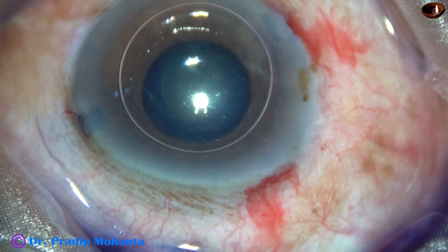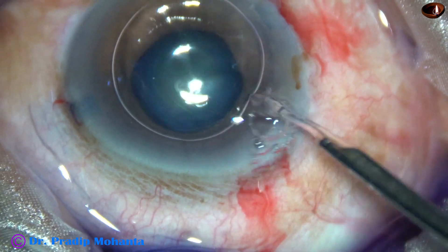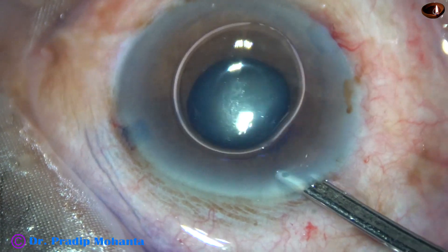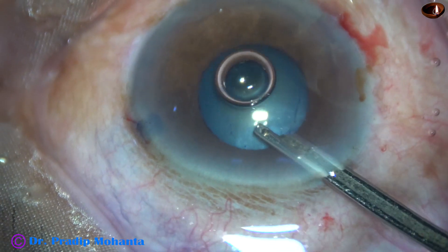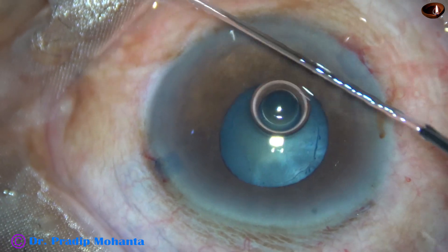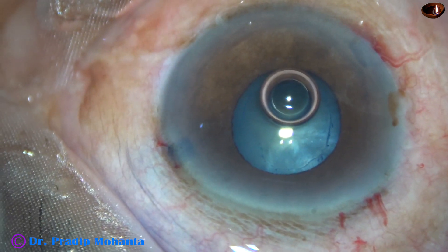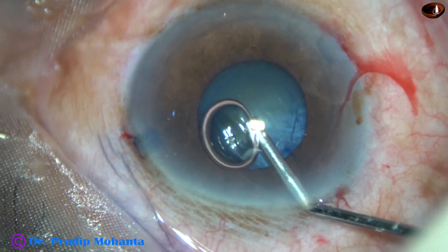I have decided to use a pupil expansion device in this case. The pupil expansion device I'm going to use is the Bhex pupil expander. It has got notches and flanges.